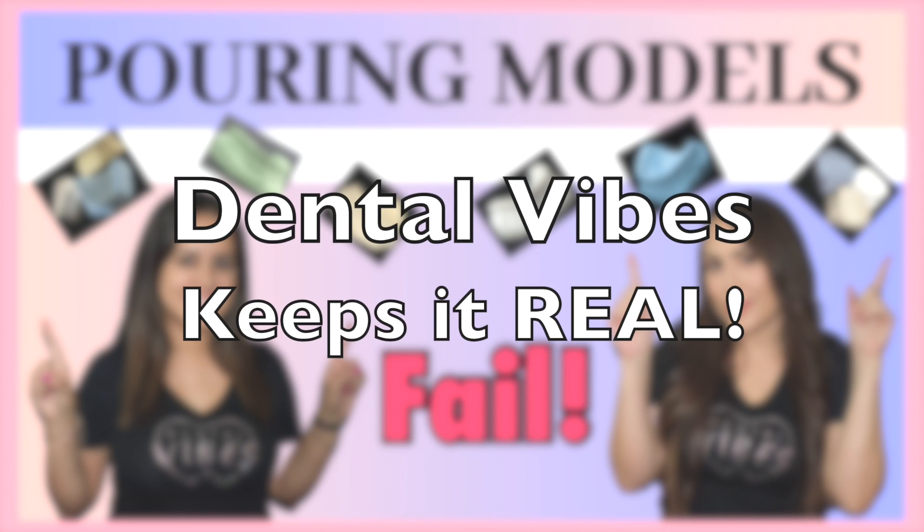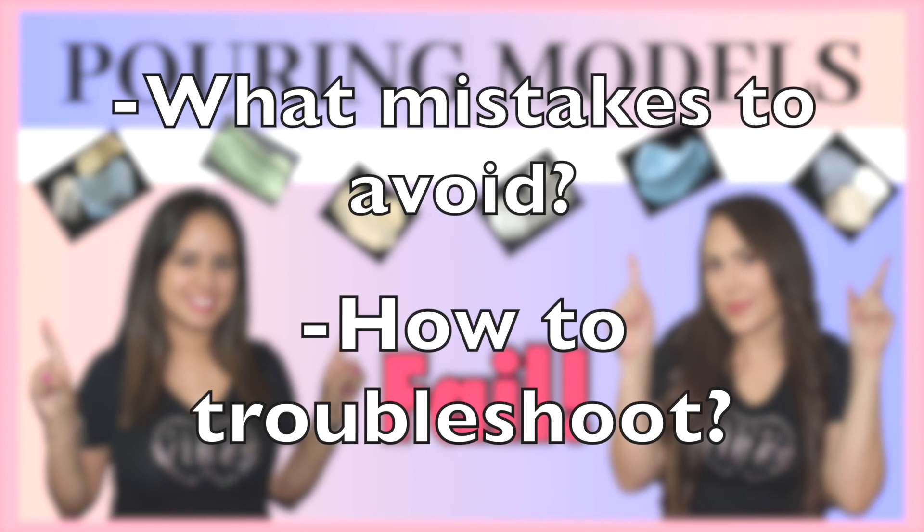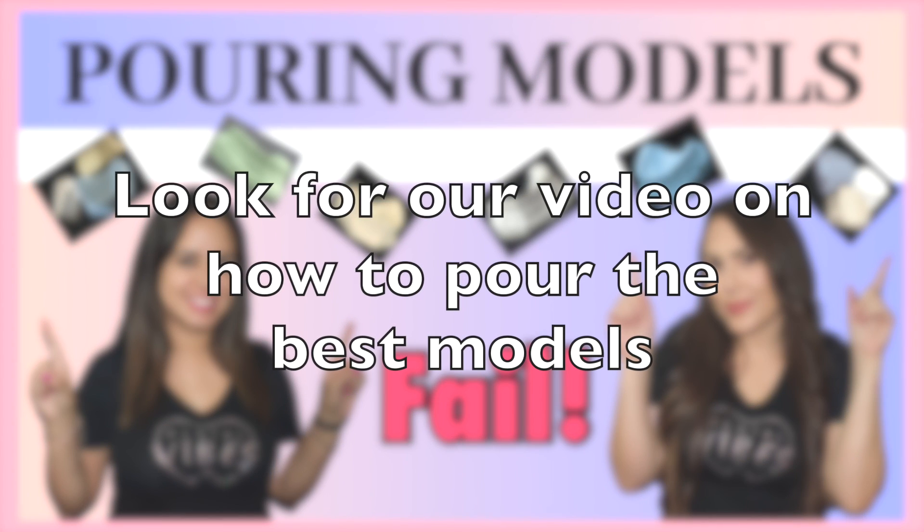It's also good to see what went wrong because we learn best from our mistakes, and here at Dental Vibes that's what we're all about. We try to keep it real because it happens even to the best of us. We were running a little bit late and it was the last video we were shooting — we were tired, the lab was really small. So it kind of relates to daily life where if you're running behind or really rushed at work, it's good to know what mistakes to avoid when pouring models.